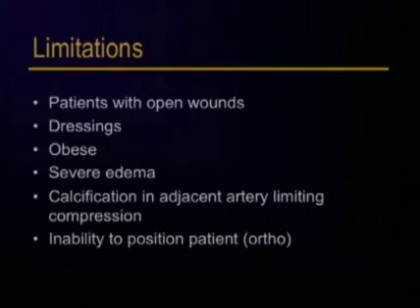Some limitations you may face: patients with open wounds cannot be compressed in that area. Dressings may also limit your ability to compress, especially in patients who have had recent surgery. Patients who are large or who have enlarged legs due to severe edema may not be able to be compressed adequately. Calcification in the artery may limit your ability to compress, and patients who have recent surgery or in pain may not be positioned adequately for the examination.